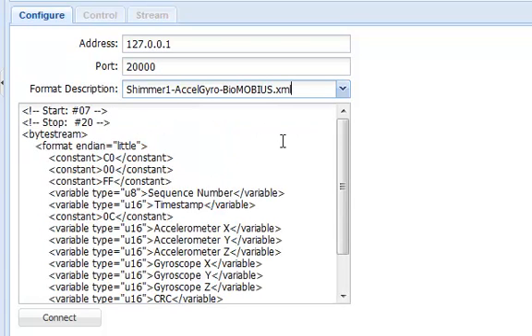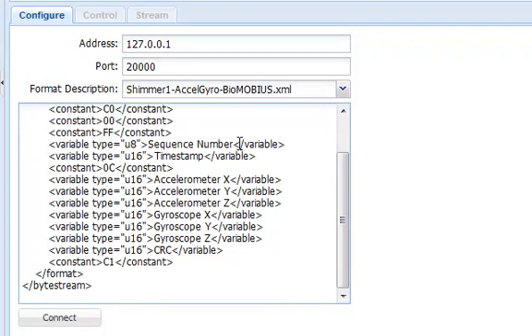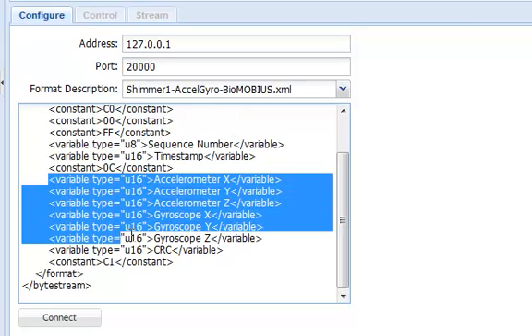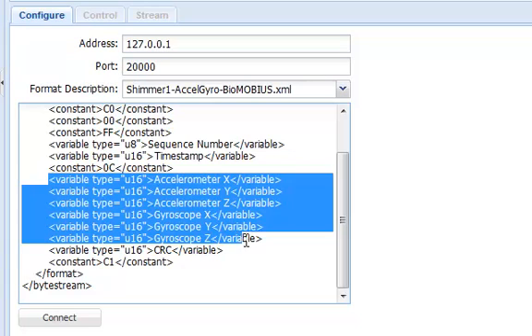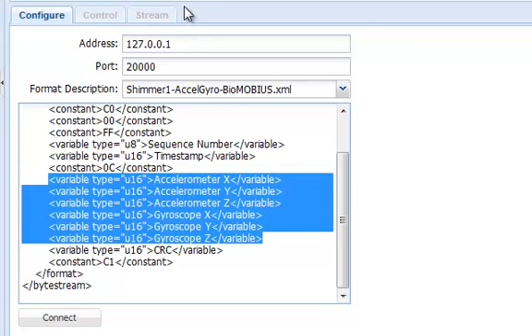As you can see, the text editor has been populated with a suitable format description file. Reading through the text, we can see variable definitions for the accelerometer and gyroscope data. These variables are parsed by the SensorMonkey control panel and made available to view or publish on the Stream tab once we have connected to the Shimmer.